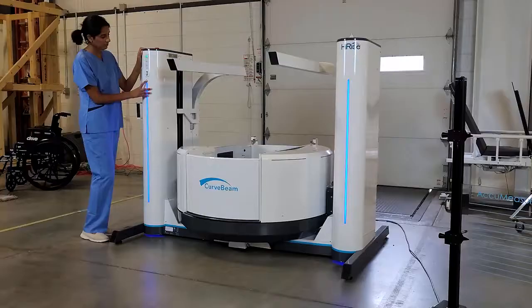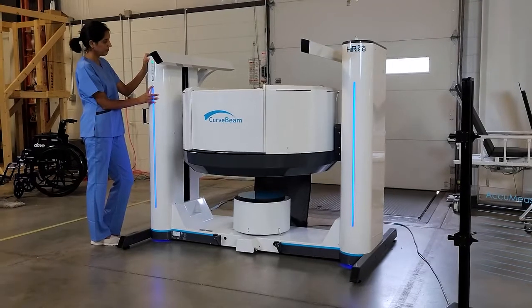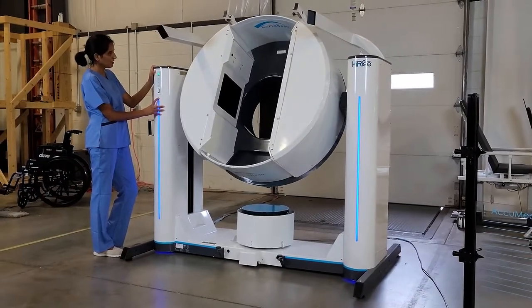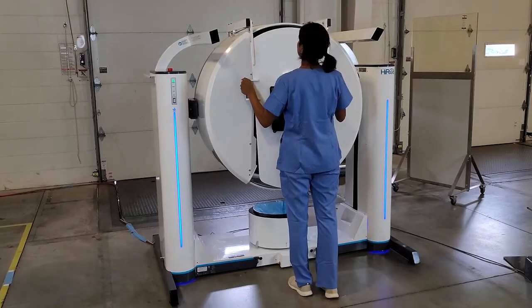The gantry flips 90 degrees for upper extremity and supine scanning. This transition takes about 90 seconds. A lead shield protects the patient from radiation exposure.